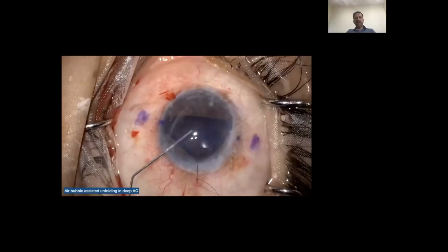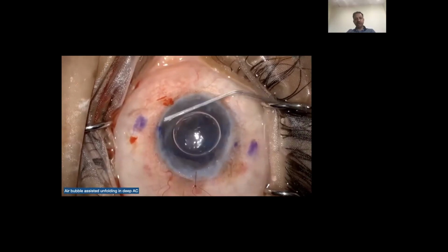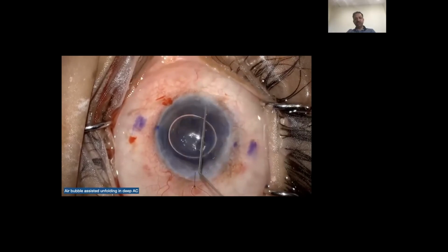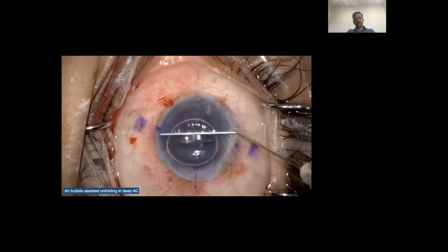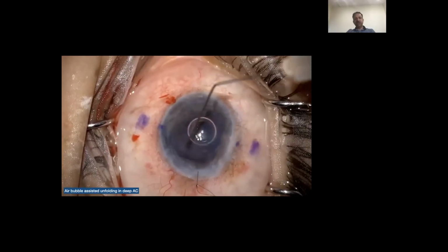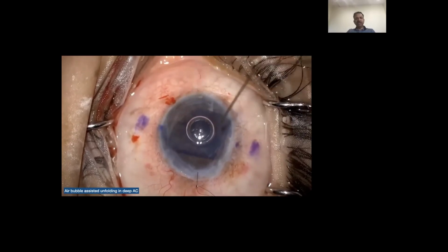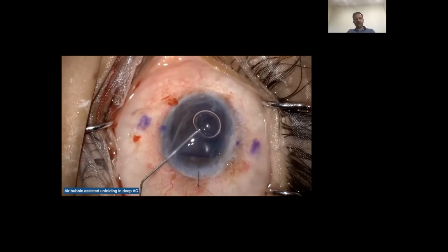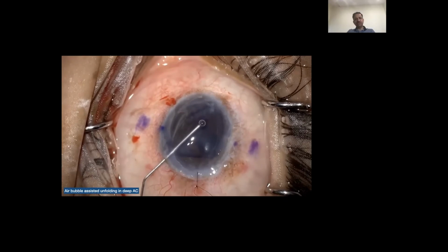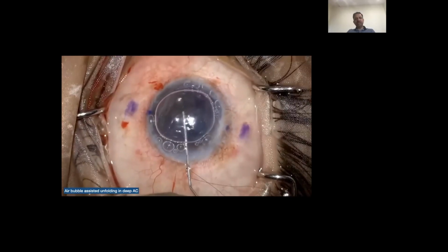In a very vitrectomized eye or high myope, which have a deep anterior chamber, sometimes you have to use an air bubble on top of the donor DM, that is within the scroll, and then use that air bubble as an instrument to help you unscroll the donor tissue. Otherwise, you end up tapping for a considerable period of time, and you find that the tissue keeps unfolding and then re-scrolling back. So here I'm using the air bubble to unscroll, and when it's unscrolled, you can gently remove the air bubble and then go below it and place a large air bubble.